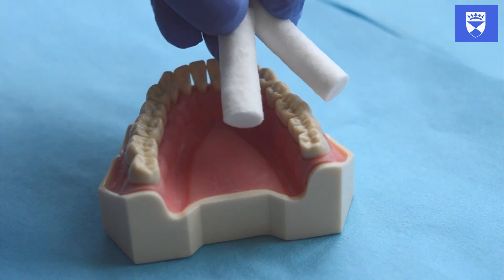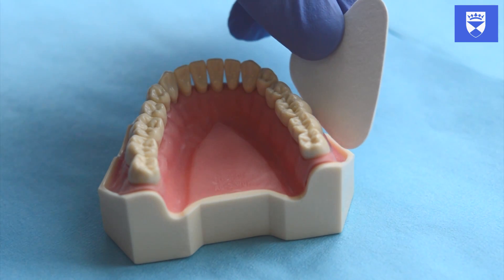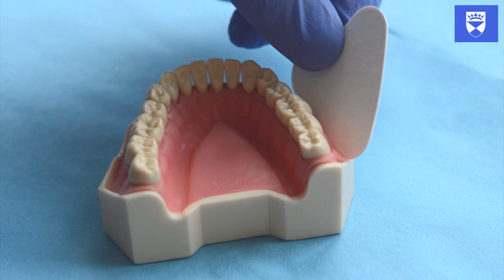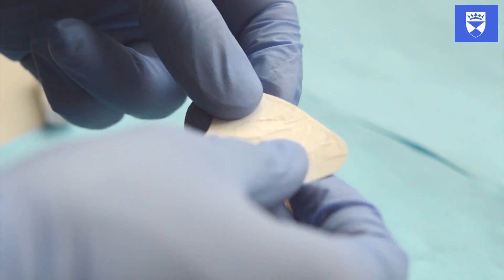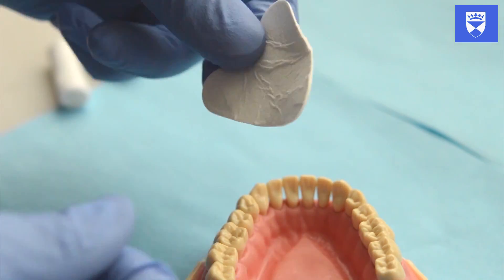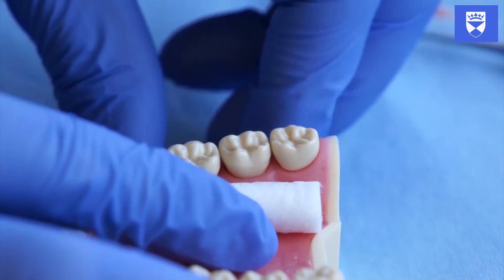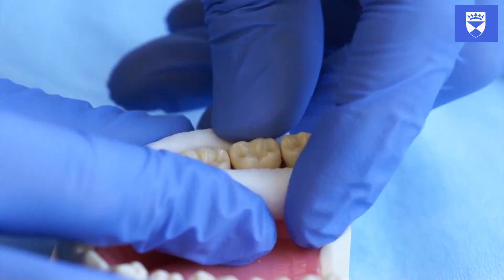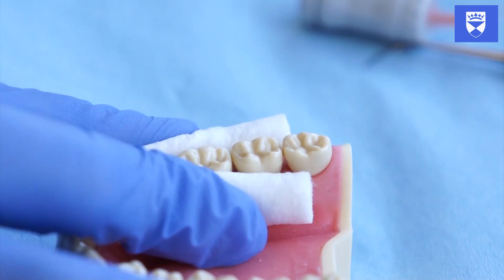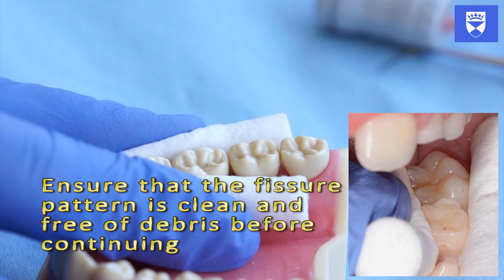Isolate the tooth and achieve moisture control. This can be done with cotton wool rolls or with the additional help of a dry guard. Ensure that the cotton wool rolls are controlled when in the oral cavity. A saliva ejector can also be utilised to aid moisture control.